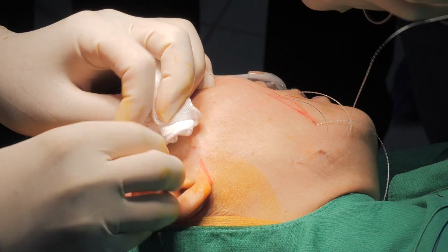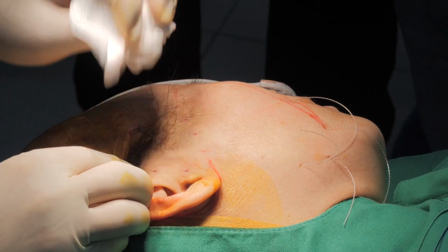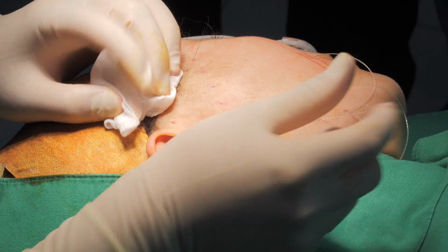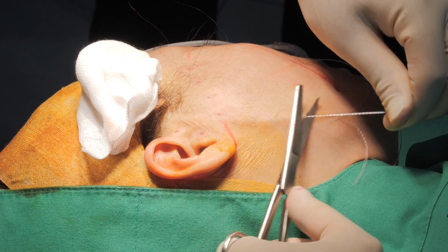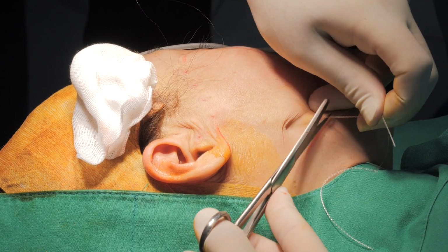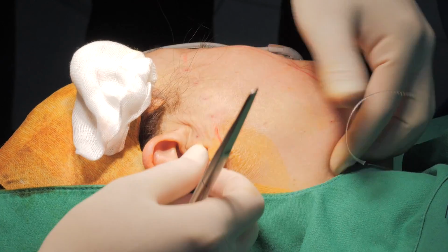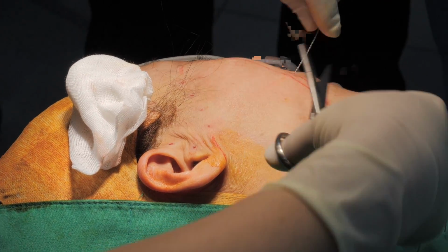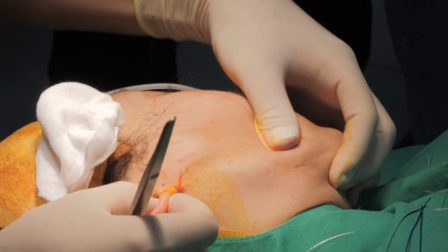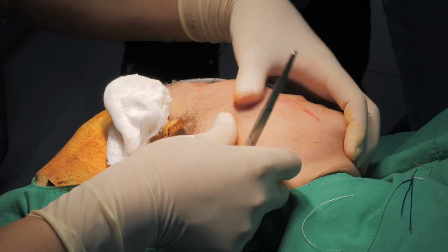Okay. So you should be very careful. You should prevent the hair inserted into the skin from causing infection. Oh no, it's already contaminated, so you can put it there. You can release the wrinkle. You should release the wrinkles.